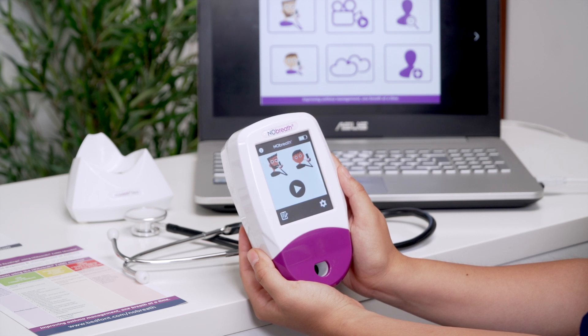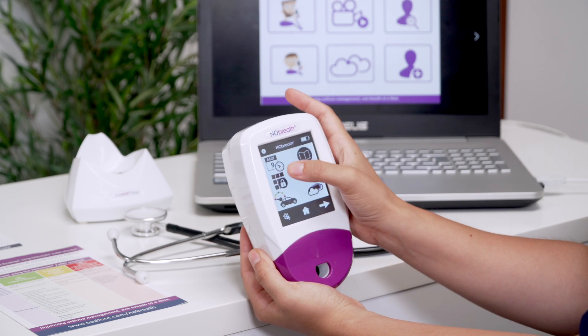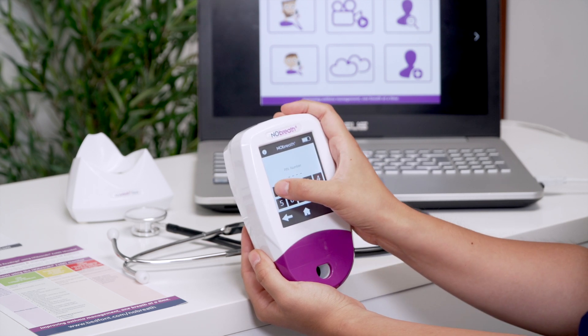To change the PIN, press the PIN Change icon from the Settings menu and you will be prompted to enter the current PIN. Enter your four-digit code and press Next to continue.